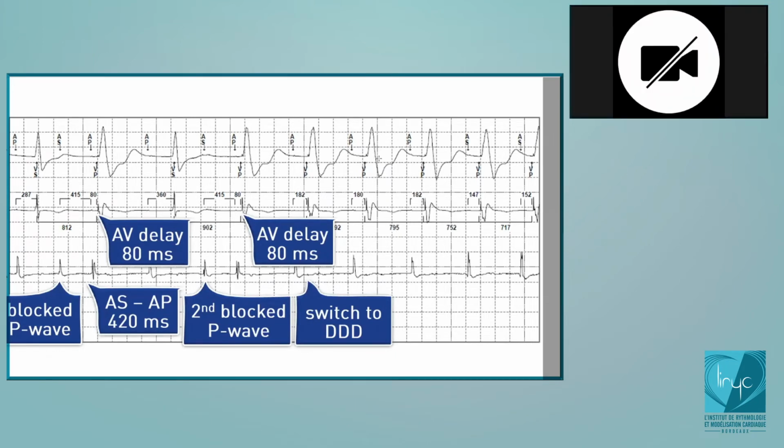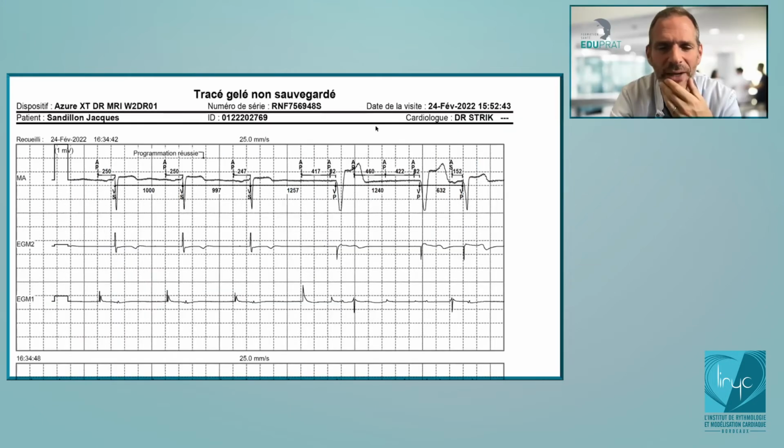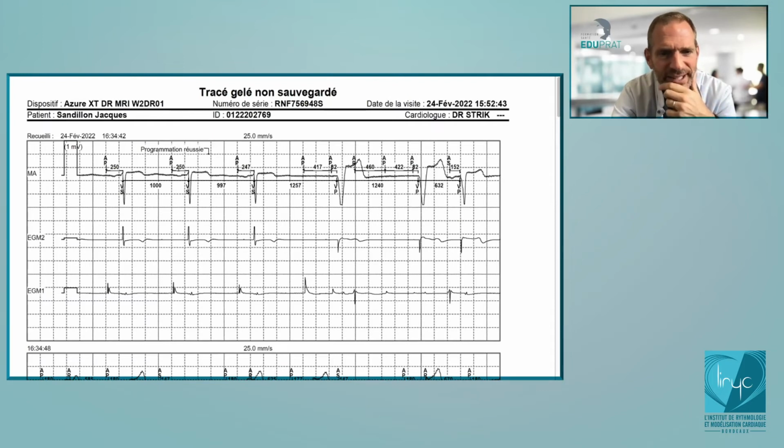Okay, thank you. Just a tracing very shortly, I will show you this: a patient with MVP. Here, APVS, APVS, APVS. Here I have changed one of the parameters. I have decreased the amplitude of the atrial pacing to be below the thresholds. So here atrial pacing is working properly, sinus dysfunction, so there is a conduction and VS, VS, VS. What I show here is that if I decrease the amplitude, then you are not capturing the atrium anymore. But if you're not capturing, then there's not going to be any VS.